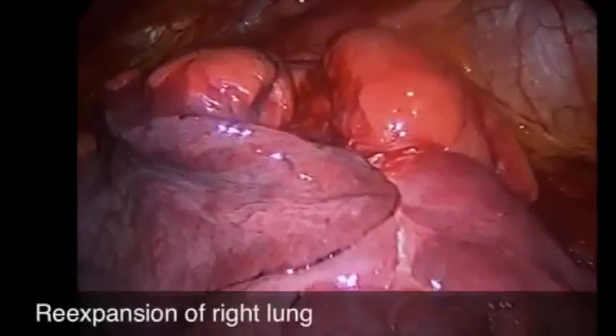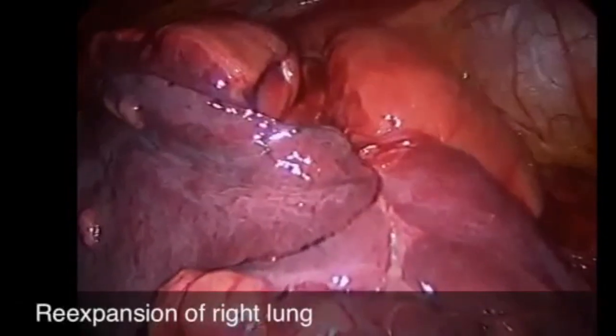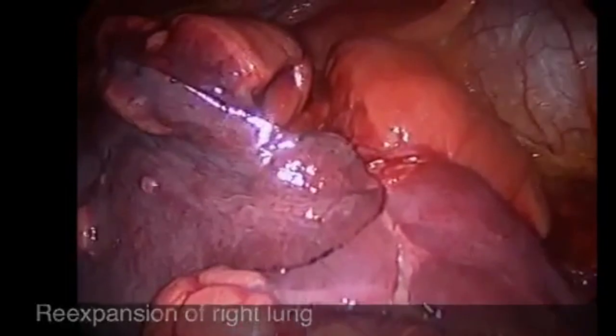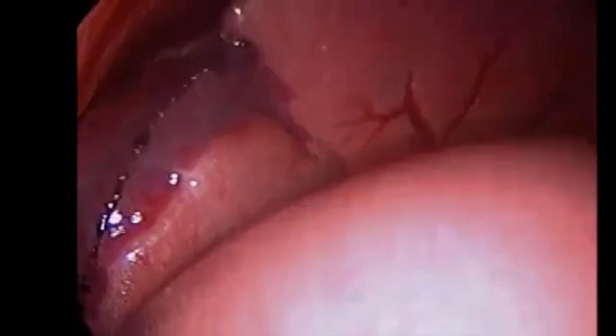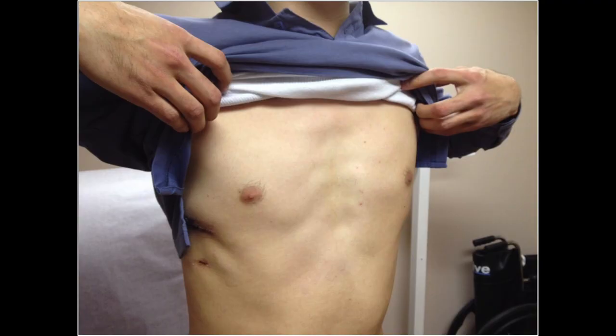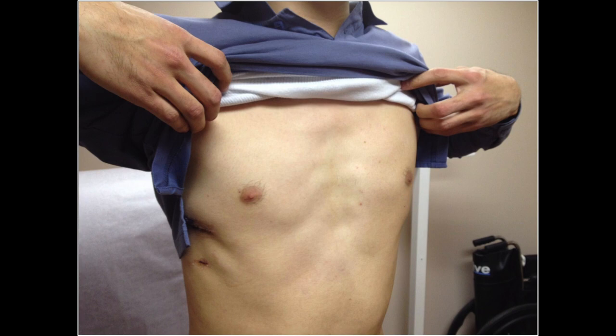CO2 insufflation is stopped, the right lung is re-expanded by the anesthesiology team, and the patient did not require a chest drain after all of the CO2 was evacuated. This is the on-table corrected defect view, and this is the seven-day post-op view of the patient's corrected pectus deformity. The patient was pain-free and not requiring any oral analgesics on post-operative day seven.